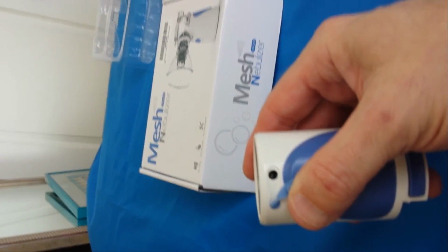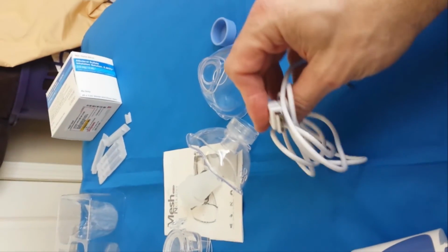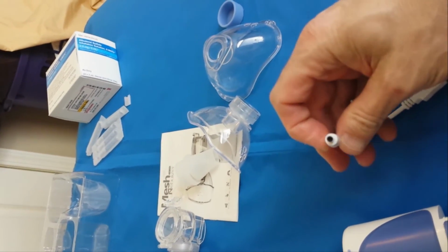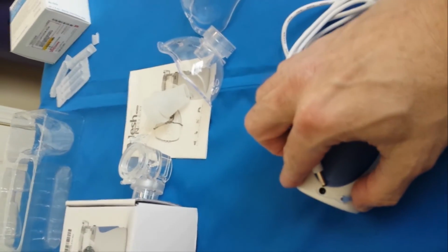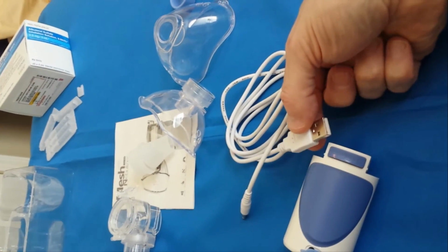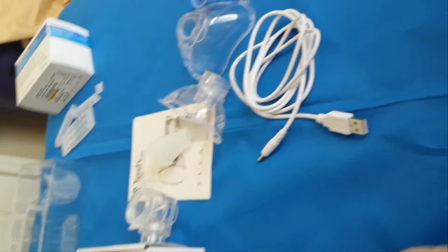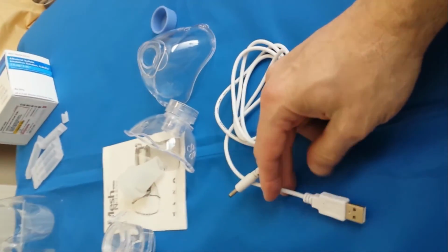Now the USB is a little 5-volt cable. One end is the standard rectangular USB plug. The other is the small round plug. When using the USB, what you would do is insert this in here and then this into a USB power adapter. Same thing that's used for micro USB adapters for your phone, your Kindle.